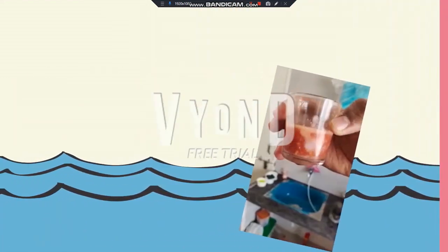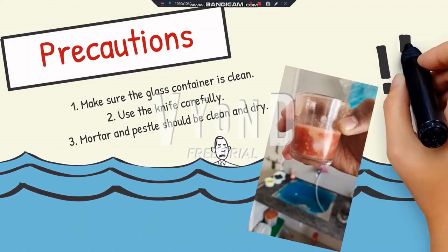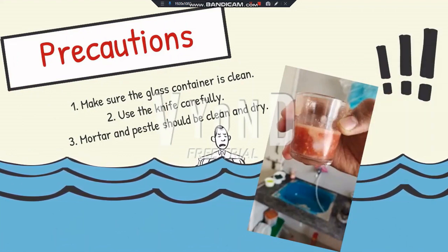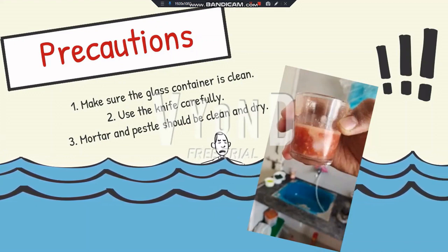In order to perform the experiment successfully, it is very important to use clean containers, mortar, pestle, etc. Then we will transfer the contents into a glass container and wait for 60 minutes. Let's watch a video for a better understanding.